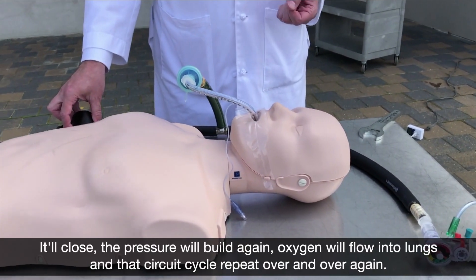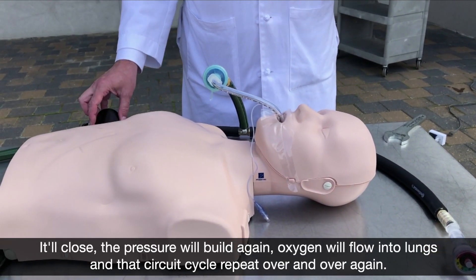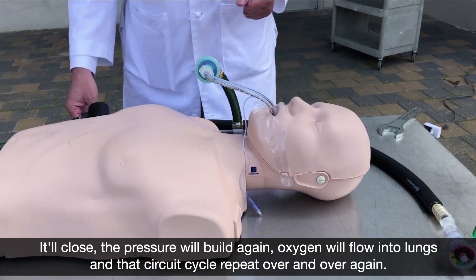It'll close, the pressure will build again, oxygen will flow into the lungs. And that circuit cycle will repeat over and over again.